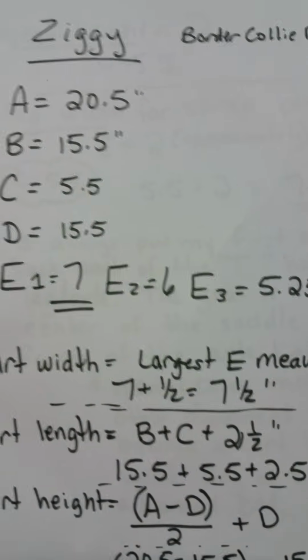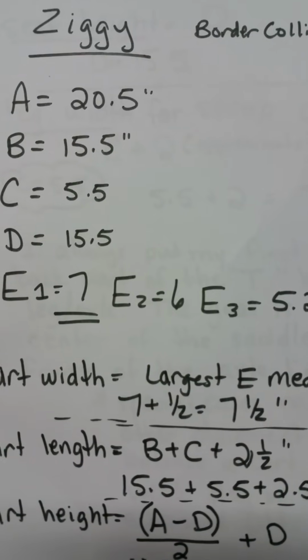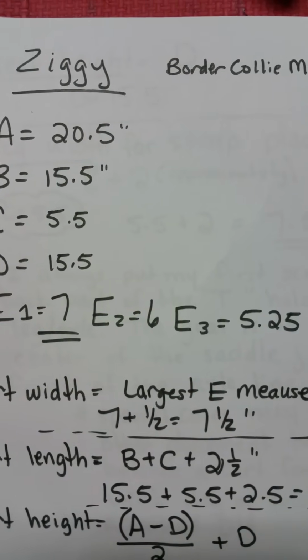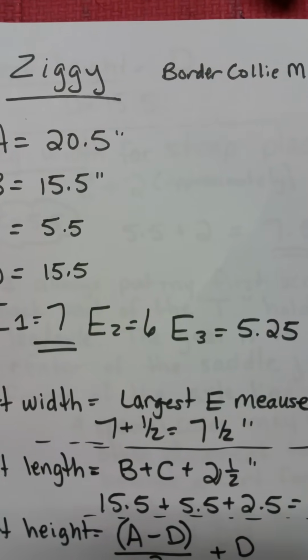The cart width is going to be 7.5 because we take the widest part of the dog, which our owner has told us is 7 inches, and we add a 1/2 inch onto that so that there is 1/4 inch on each side of the dog of wiggle room.